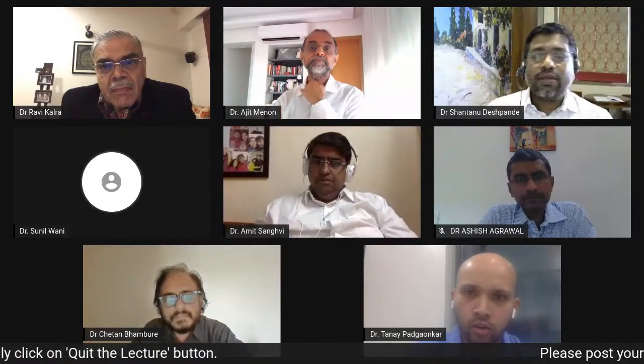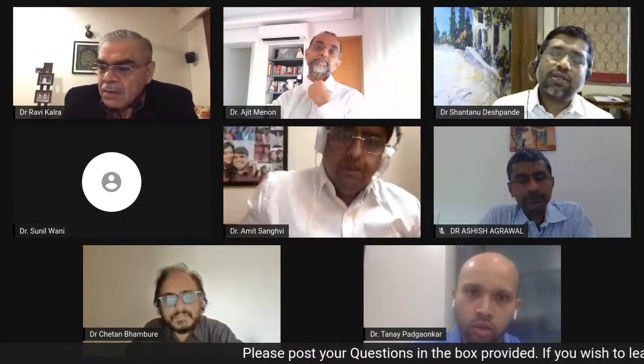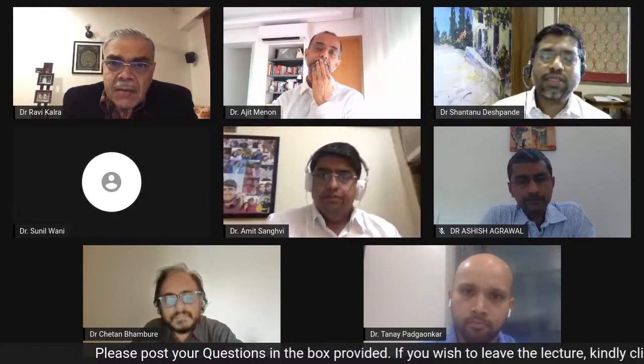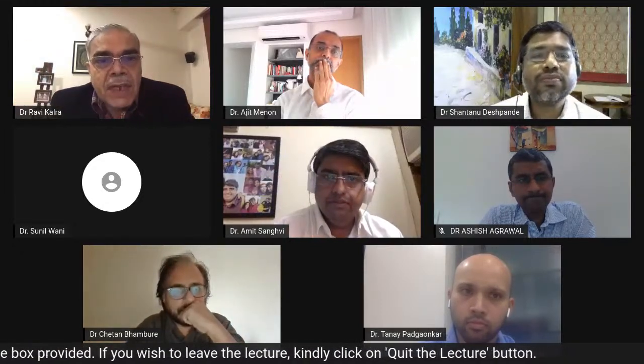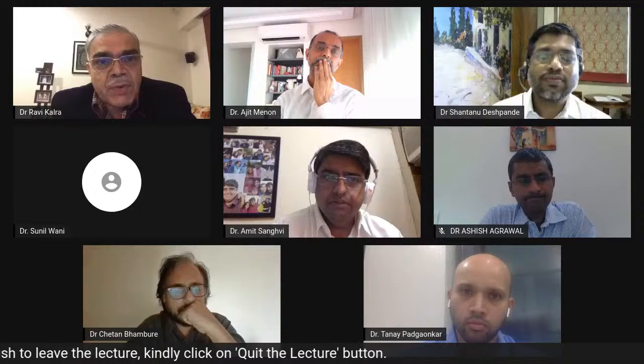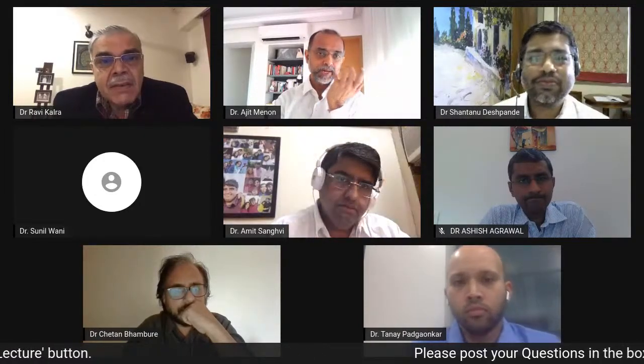So that video, actually I had not included, but I had pre-dilated with a 2.5 NC balloon for the diagonal ostium. Just a thought: what about a drug-eluting balloon to the diagonal, Dr. Menon? What would you do?